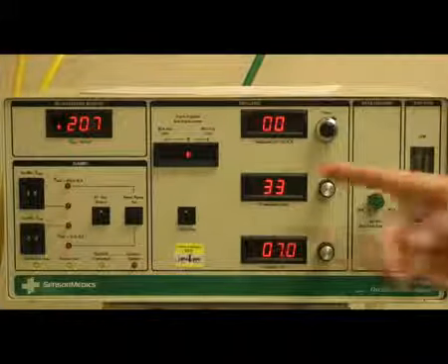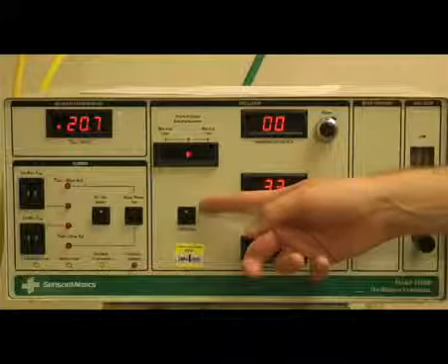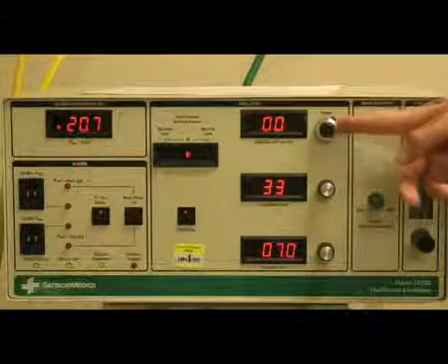You will then turn the piston back on, reset your delta P to 90 centimeters of water pressure, and observe the patient for 10 minutes.